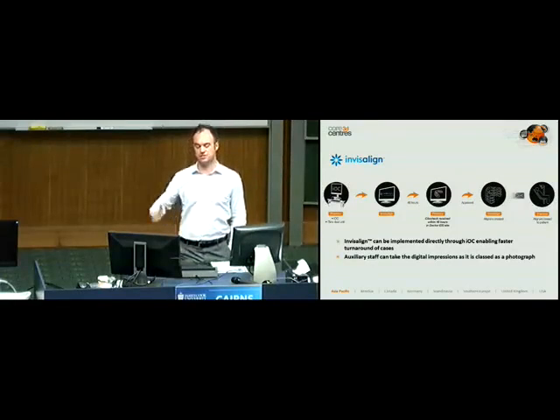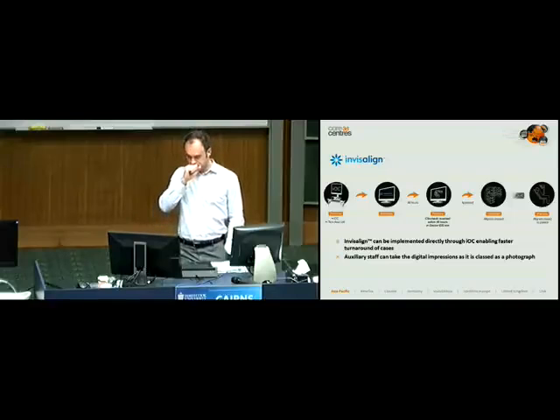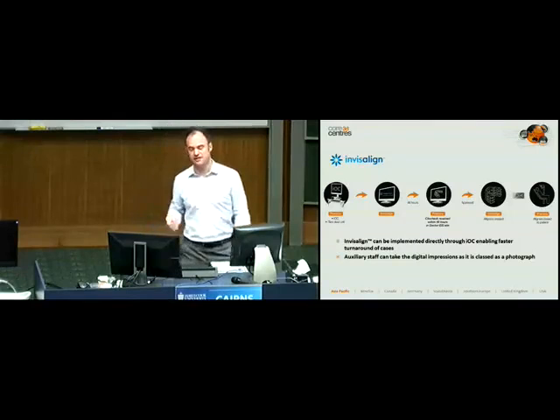So from the day you've scanned the patient, 48 hours later you'll have the teeth aligned for you to check and sign off. If the technician has done the job right and it's ready to go, you press OK. The fastest turnaround time we've had for Invisalign is 9 days. So from the day the patient came in and was scanned to when the aligners arrived through the door was 9 days. So you can see why Invisalign really like this technology and they invested so heavily in it.